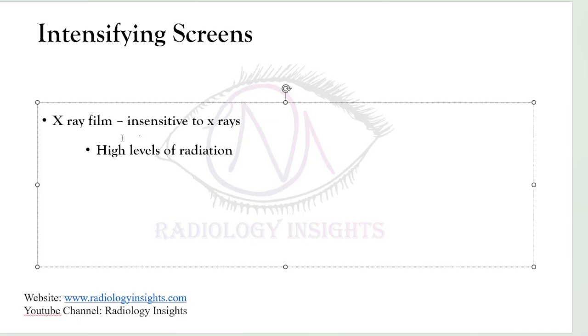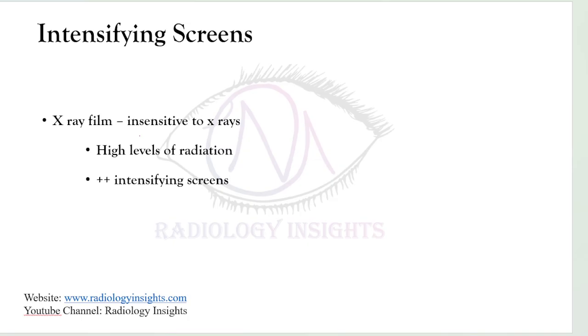With an exception of intraoral dental radiography, the film used in clinical radiography is always used in association with intensifying screens, which convert the X-ray pattern or X-ray intensities into light.